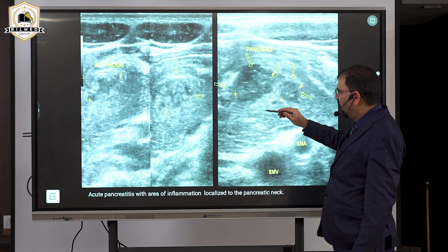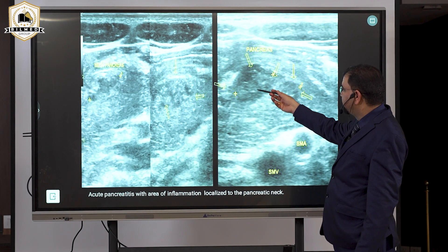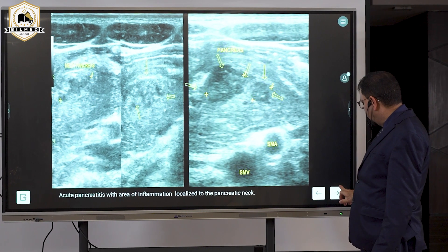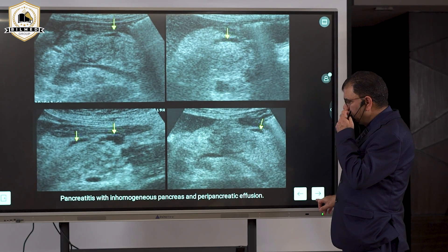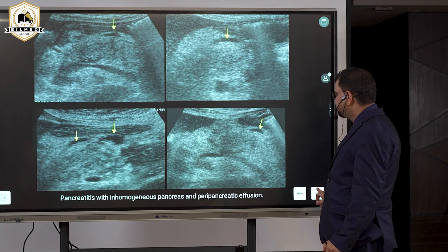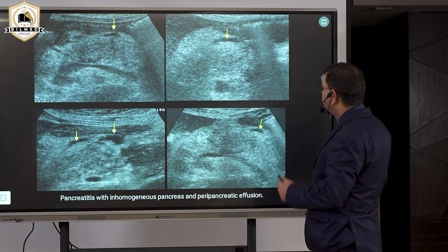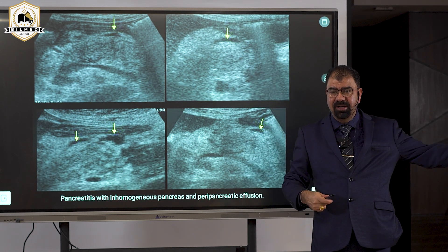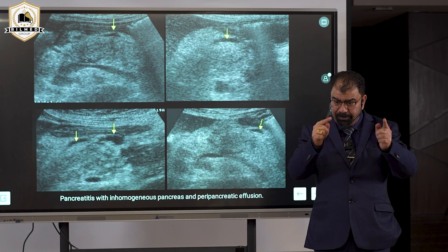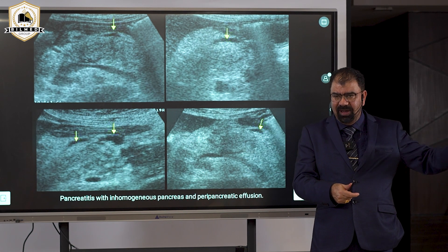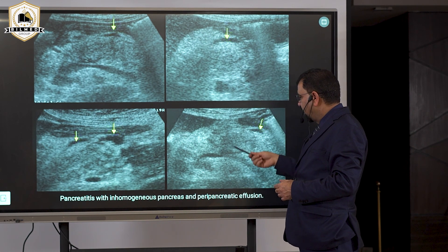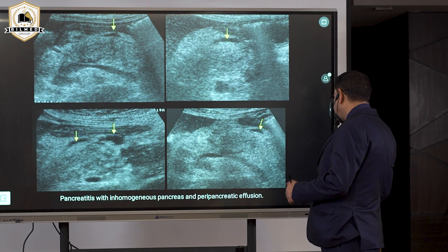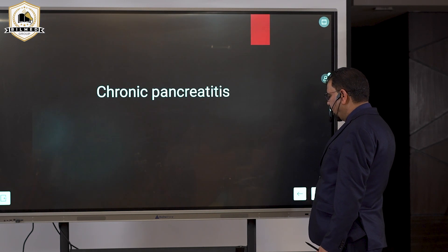Here you can see the stomach and how the pancreas is less echogenic than the liver. This confirms pancreatitis. You can also see dilatation of the pancreatic duct. Try to obtain a picture of the pancreatic duct. If echogenicity is equal to or less than the liver with increased size, you are dealing with pancreatitis.